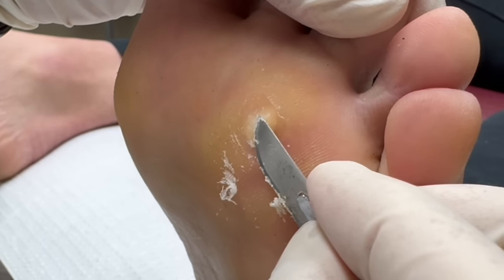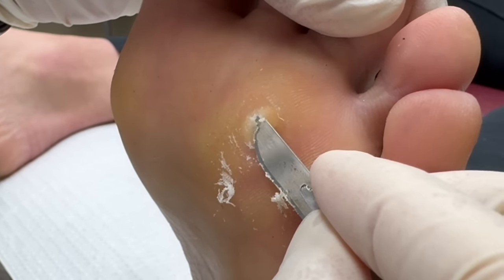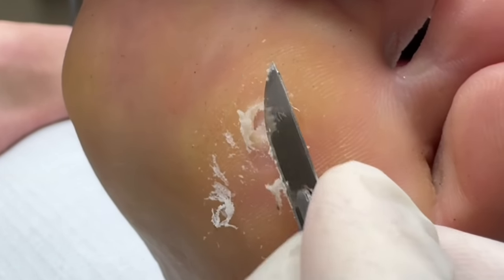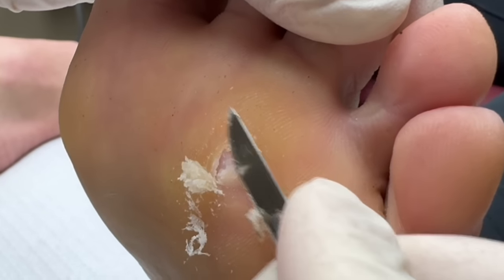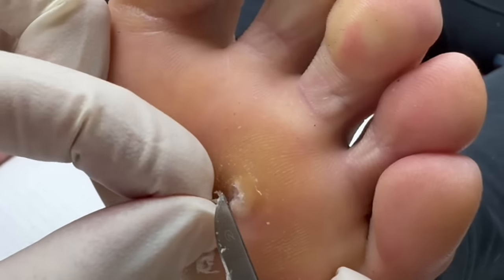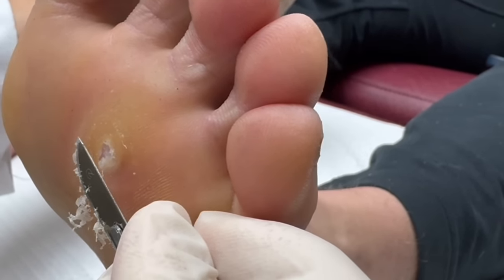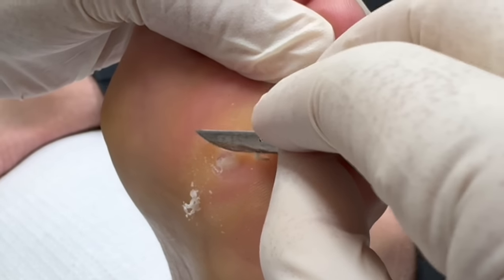I'm trying to tease off that. You feel okay? Yeah, I don't feel a single thing — my feet are so calloused up. So you can see that I'm coming out now. That's the deeper part that was embedded, as you can see. You can see that whole thing coming out in one piece. I'm going to show Justin. That's part of it — there's a little bit more I need to get to.